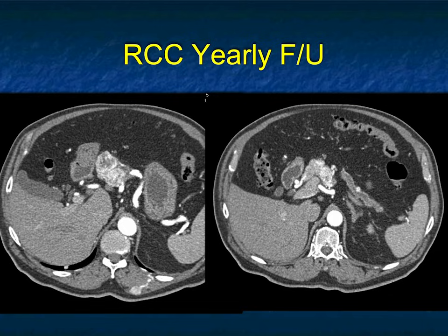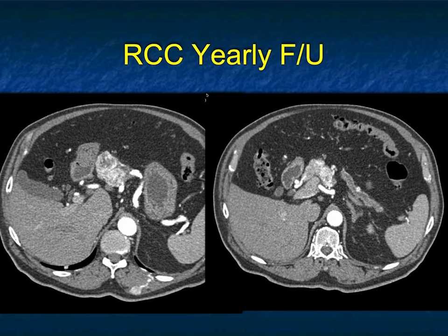This patient had renal cell carcinoma with yearly follow-up. You can see multiple enhancing lesions in the head of the pancreas with a dilated pancreatic duct, and also an enhancing lesion in the left paraspinal muscles. We always think about neuroendocrine tumors for vascular lesions in the pancreas, which is the right thing to think about, but once a patient has had renal cell carcinoma, you've got to think about metastasis to the pancreas. Typically it doesn't occur at presentation — it typically occurs 10 years later.